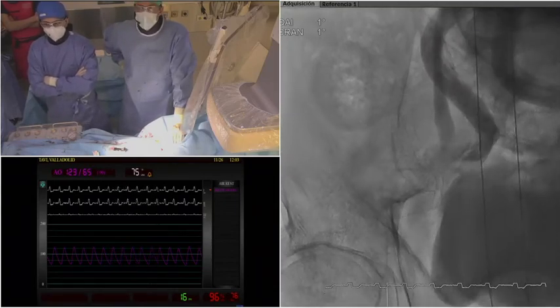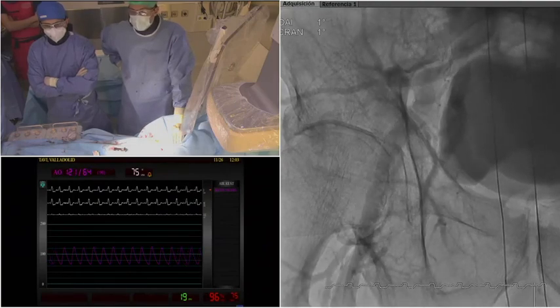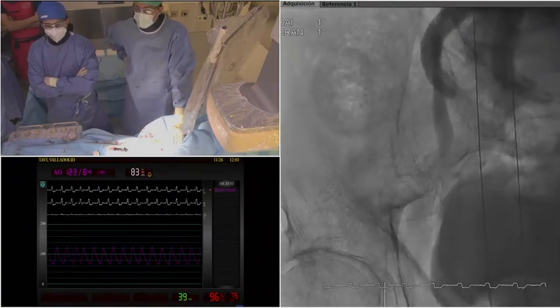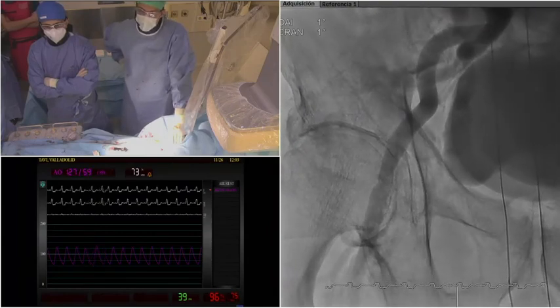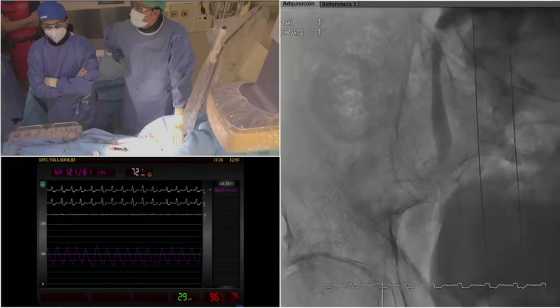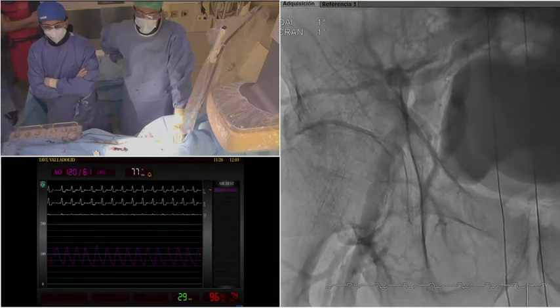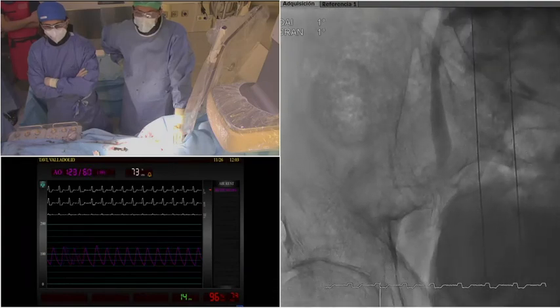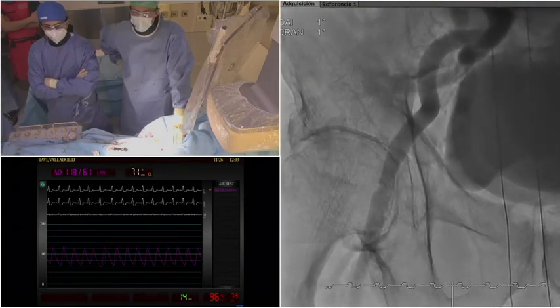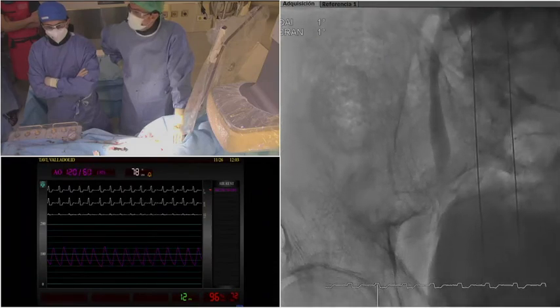Yeah, I agree. It's an issue that we still need to learn more, but left bundle branch block, we have been including these patients in the MARE study, with a reveal implantation, with a continuous ECG monitoring. There are very few events, but there are in these patients with left bundle branch block. So even out of the study, we continue with this strategy of continuous ECG monitoring once the patient goes out.